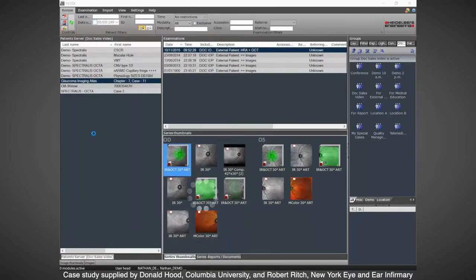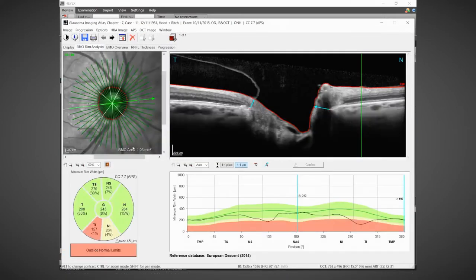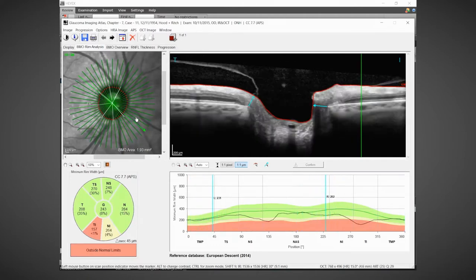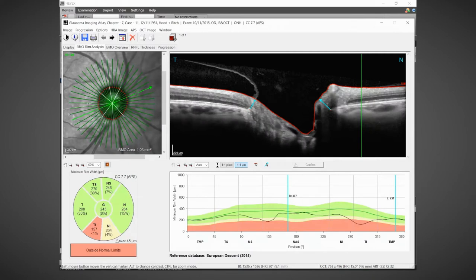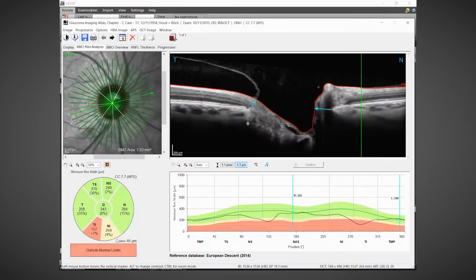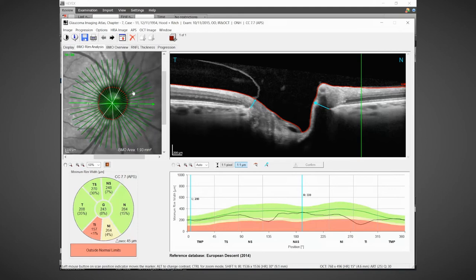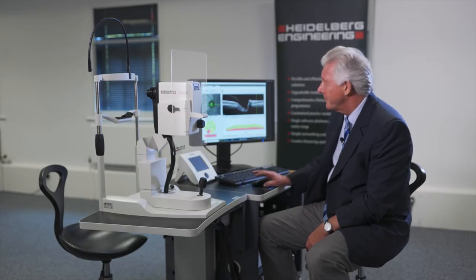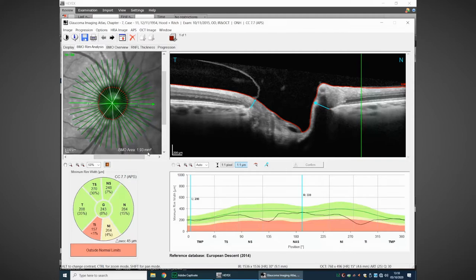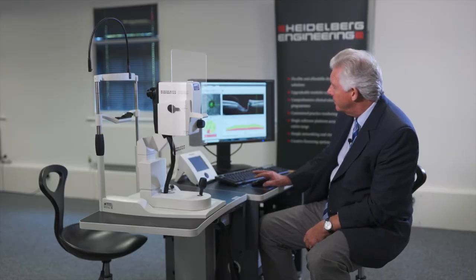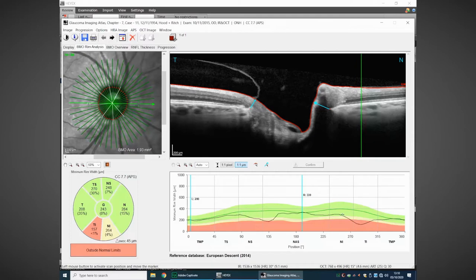Let's look at our OCT. We look first at the neuroretinal rim — we have identified 48 locations of Bruch's membrane opening and we can measure from Bruch's membrane opening, the true anatomic disc margin, to the inner limiting membrane, giving us the minimum amount of rim tissue all the way around the optic nerve. From these 48 locations we identify the disc size; in this case the patient has a disc size of 1.93mm², which is a fairly average size disc, and so the profile of the neuroretinal rim should follow pretty much the green line in the middle of the normative range.